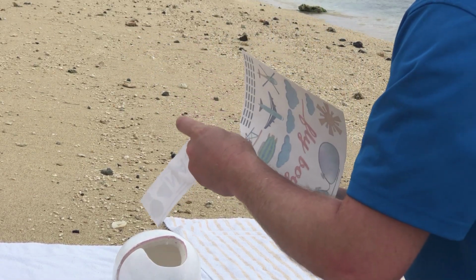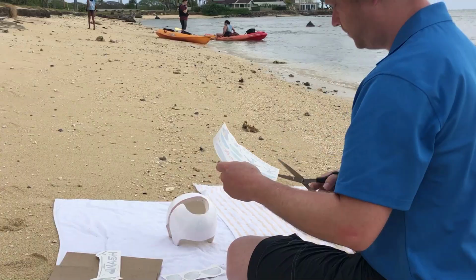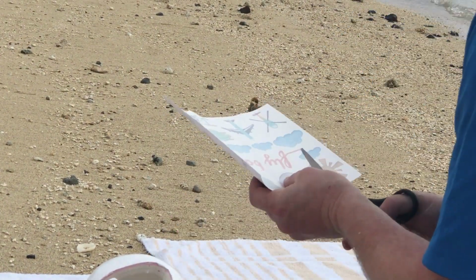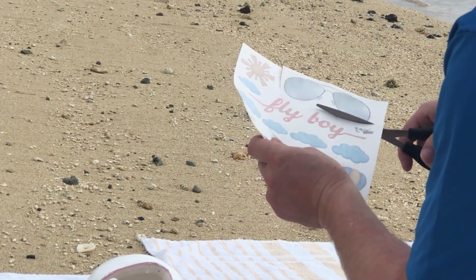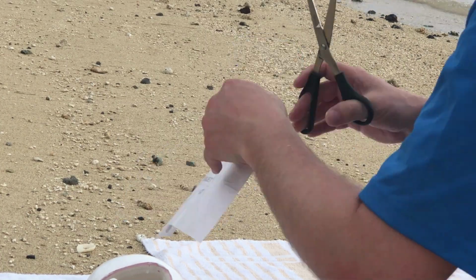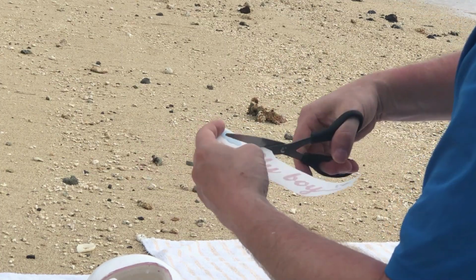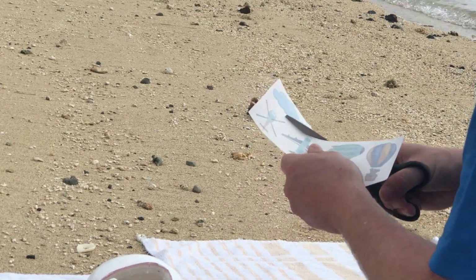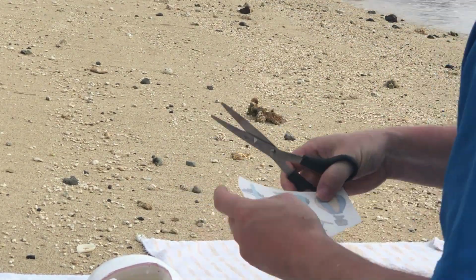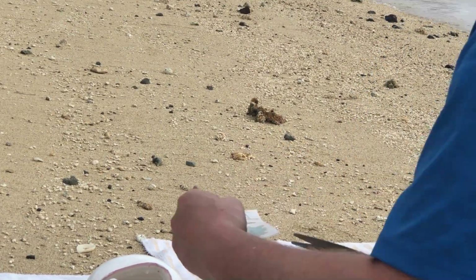I didn't show it, but your package contained a small square of sandpaper. Please take that sandpaper and rough up all the surfaces of the band. I used to just recommend that you wash the band with rubbing alcohol before applying the decals. But every once in a while, a band would have a slick coating and the decals would not stick. I found that sanding with fine sandpaper always fixed the problem, so I recommend you just take a minute to sand. You are not trying to remove plastic, just roughen the surface.